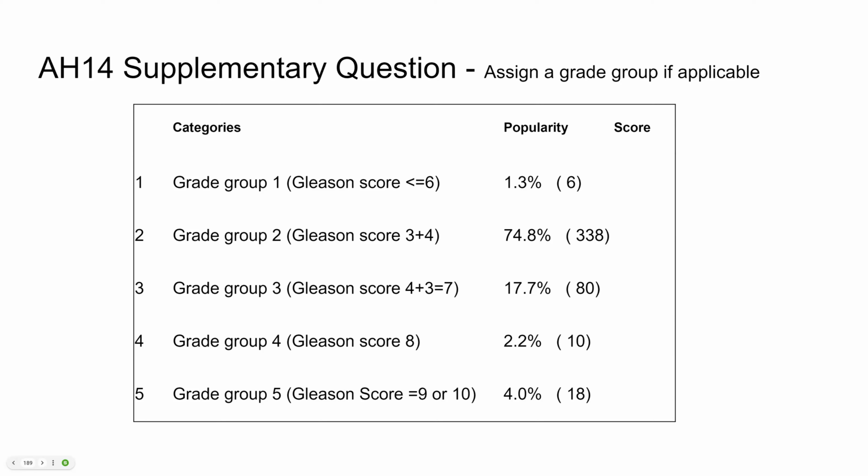And then there may be what we would consider unacceptable, for want of a better word. Don't like that word really, but that's maybe Gleason group 1, because there was definite pattern 4 in there, which would have a clinical impact on discussions at the MDT and treatment of the patient, particularly that amount of Gleason pattern 4. So that may be considered to be scored 0.